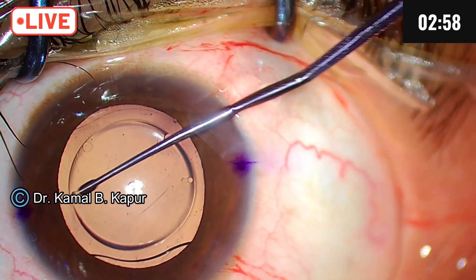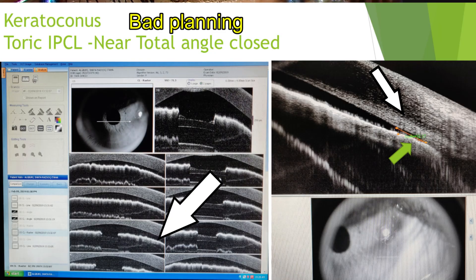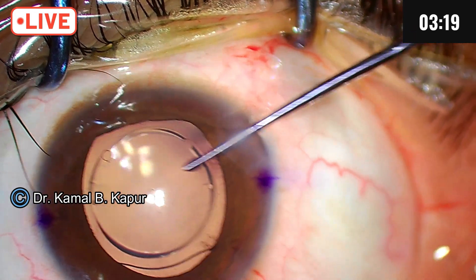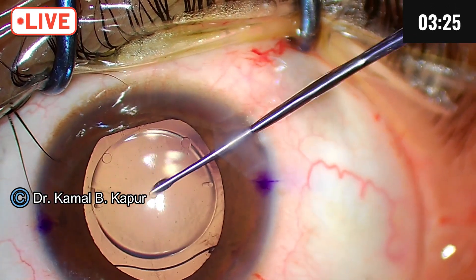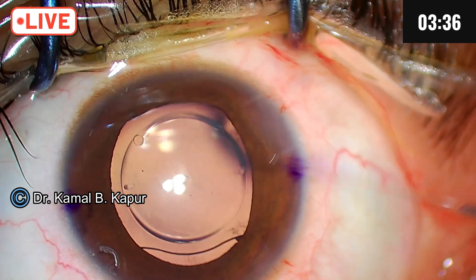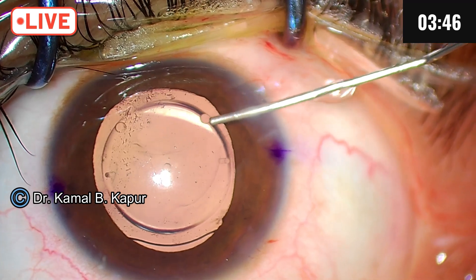On average, any fakic lens will reduce anything between 15 to 20 degrees of angle, so your preoperative angle has to be about 40 degrees plus. I'm rotating now — if you notice, I'm not touching the central part of the lens. The axis alignment has to be very, very accurate. I'm putting some pilocarpine in; normally I don't, but in these cases since we are planning a slightly higher vault, the lens during irrigation and aspiration will have a tendency to vault out due to the fluidics.